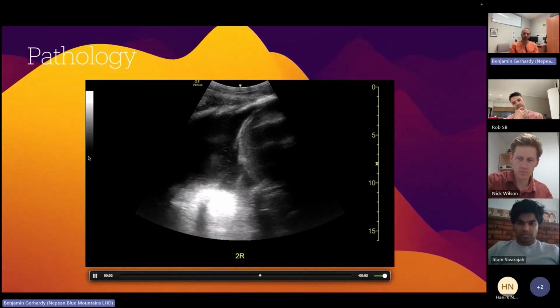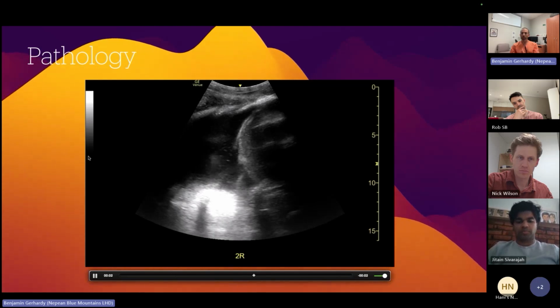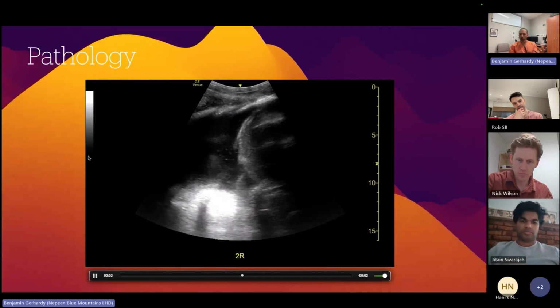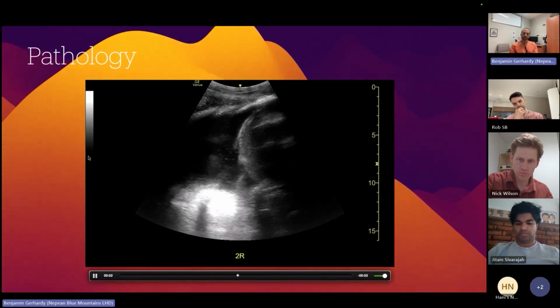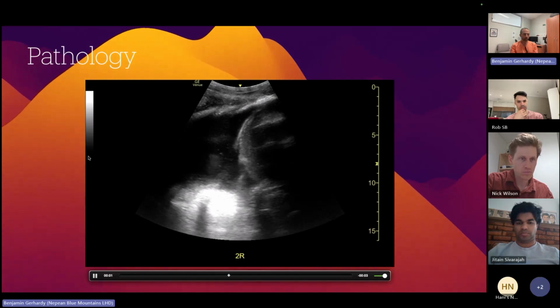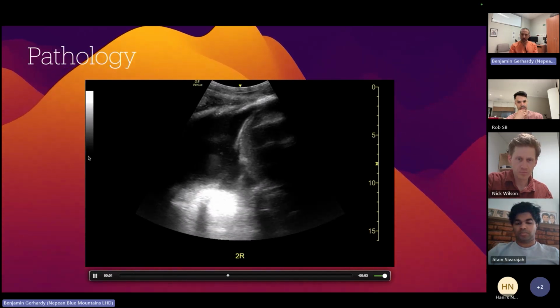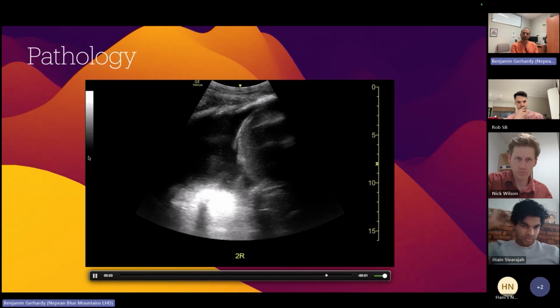So you put a probe on someone's chest, you see this in terms of an effusion, and you can really confidently say that there's a high percentage of blood in there. It may not all be blood, of course, but there's a lot of blood in there, hence that swirl. So that's the plankton sign. Stuff like this is absolute fodder for the DDU viva. They just show a single cine like this for some of the stations, and we'll say, all right, what is this? And it's like a spot diagnosis station.